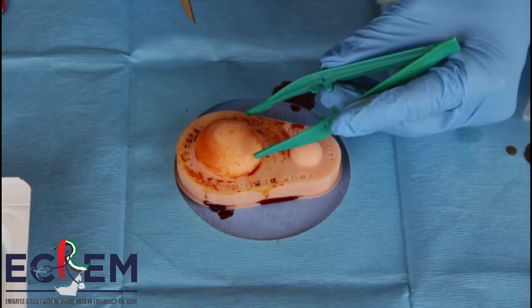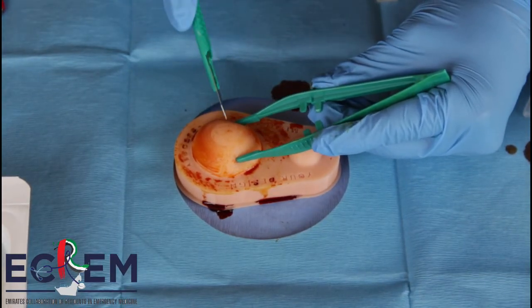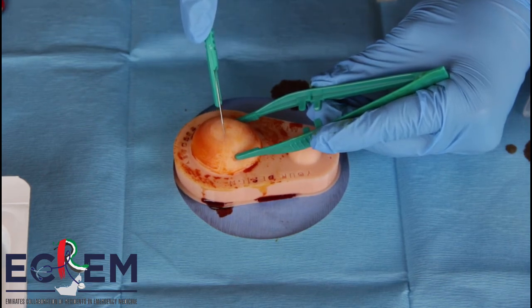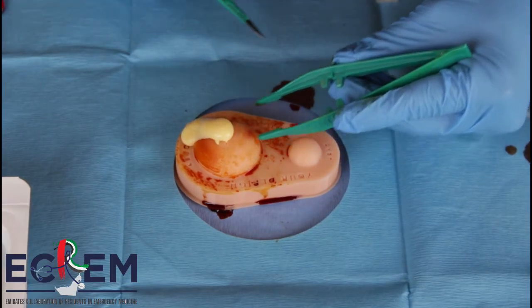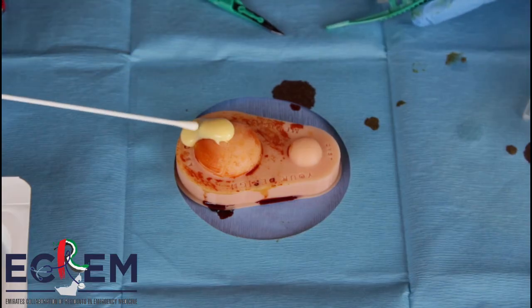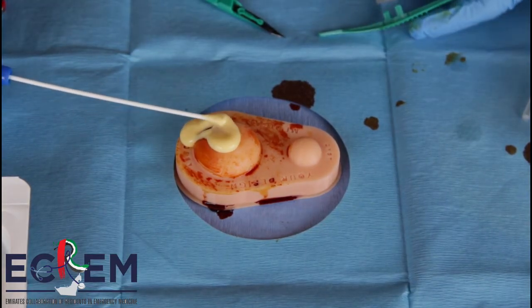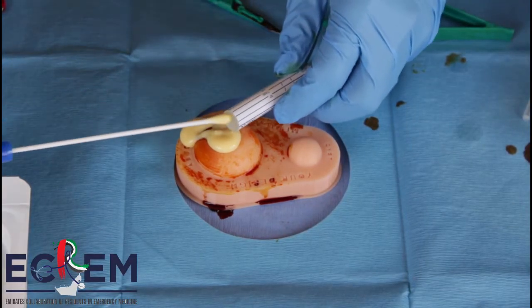We are going to apply a mild tension on the skin with forceps. Now you make the incision. Now you take the pus — you do the swab, which is required for the culture. Make sure you are collecting it.